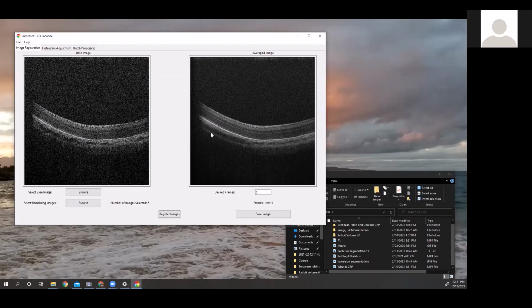And then the other thing I'd point out is that you see even more detail in the retinal layers. You can see the line kind of coming through in this layer, but now it gets nicely accentuated as well. And you get down here into the outer segments as well. Those really start to accentuate in the average images. That makes it a little easier for doing the segmentation later on, as well as for more precise types of measurement.